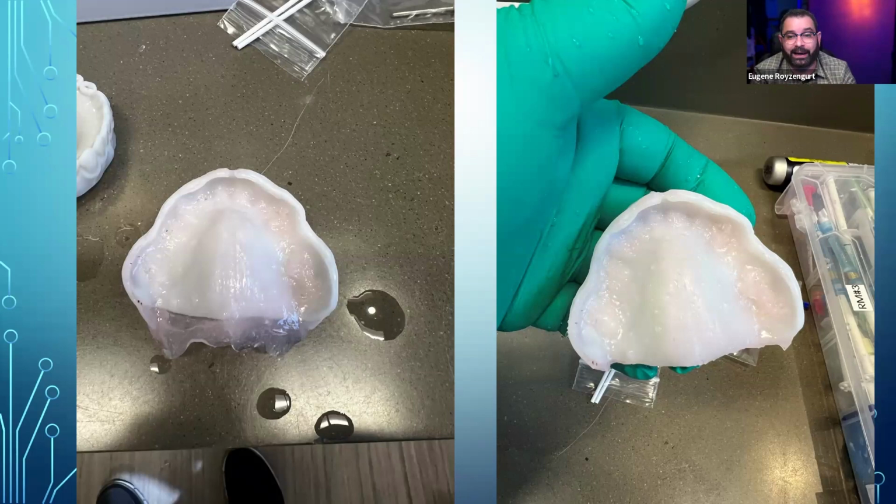So I'll do a try-in, and then I'll print that try-in and give it to them to wear for a couple of weeks to make sure the bite stabilizes. And if it stabilizes, then we'll move forward to get things done.